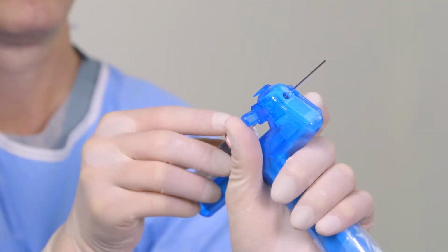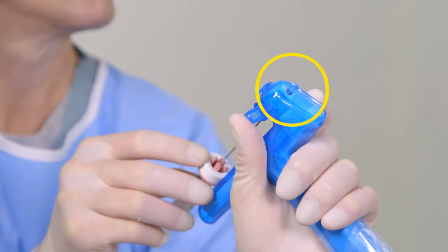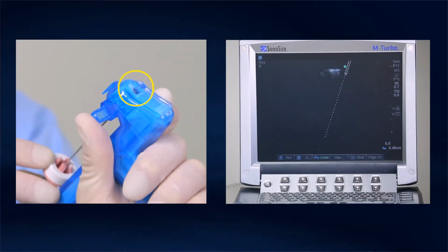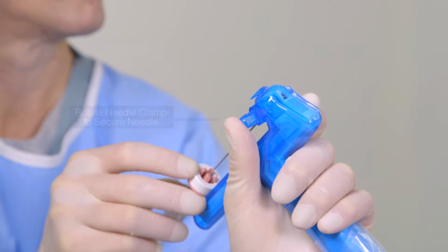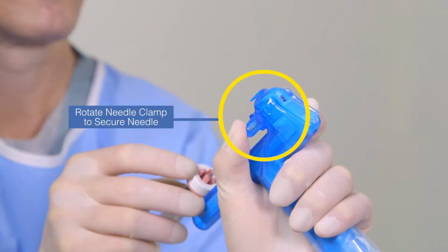Now, move the needle until its tip is just protruding from the base of the sterile shield, and confirm on the sonogram that the virtual tip is visible at the top of the sonogram. Observing that needle movement is synchronized and that the virtual needle tip is properly located on the sonogram confirms that the system is ready for use. At this point, retract the needle slowly until the virtual needle just barely disappears from the sonogram. Then secure the needle in place by rotating the needle clamp backward with your thumb to the closed position.